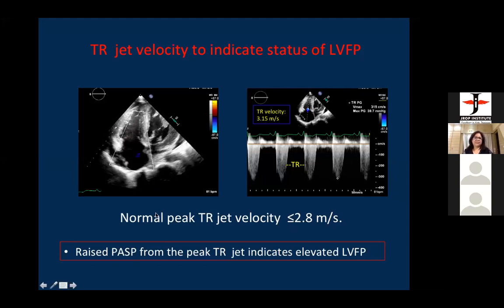Third important point, we are looking at only one section of the tricuspid regurgitation, in one section of the RV-RA. The RV-RA is not one section; it is a three-dimensional structure. We do not know whether a posteriorly placed jet may be causing all this. Fourth important point, the tricuspid valve is a trileaflet valve. It has septal, anterior and posterior leaflets, so the direction of the jet could be in some other format also. But once we do a Doppler, Doppler will interrogate any jet velocity. That is the reason that when we look at very small, tiny jets, you get a good Doppler spectrum pattern, as shown by Dr. Debika.